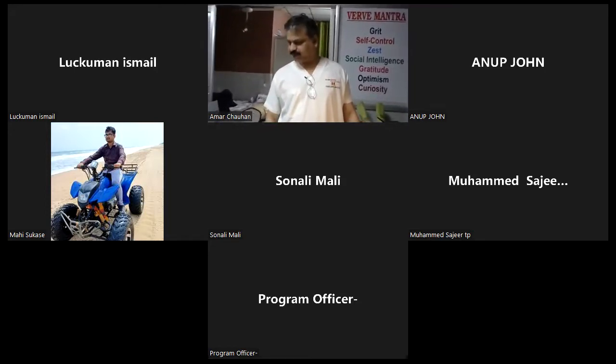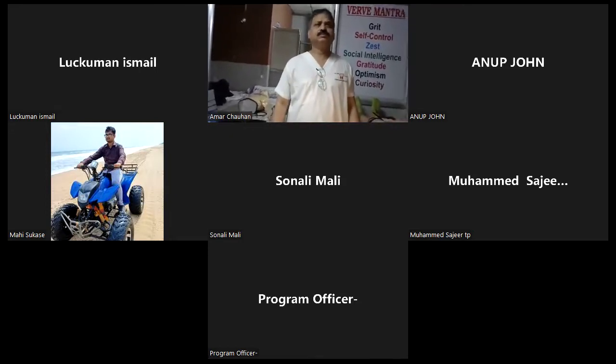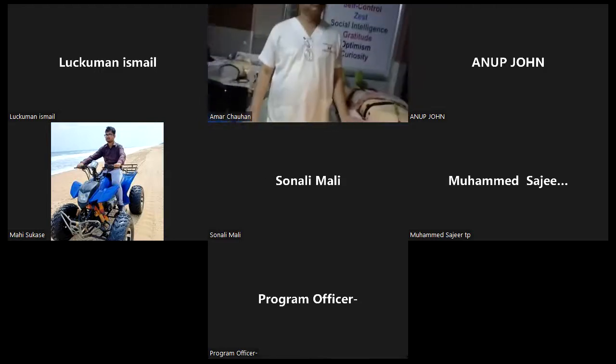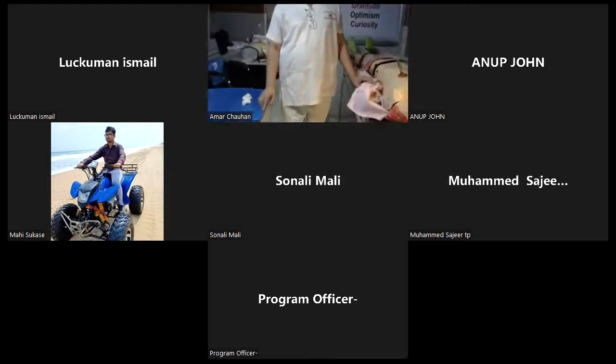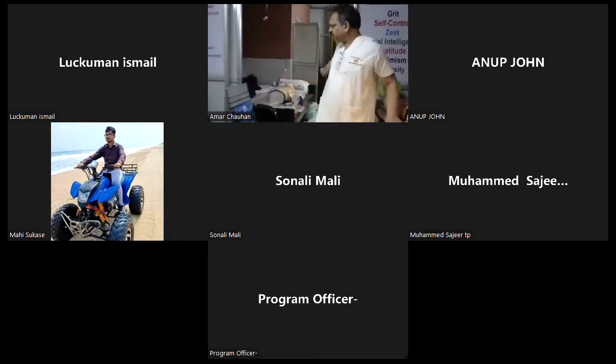Yeah, adult, sir, QCPR. I have one more doubt. What about the refilling of the ink? How much simulation can be done per mannequin? So, general idea.